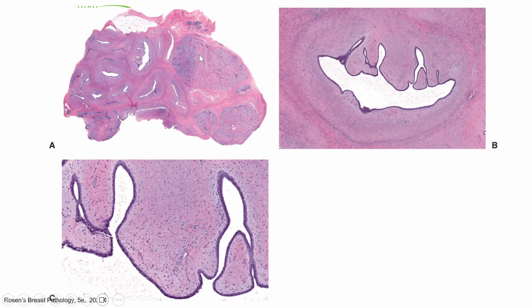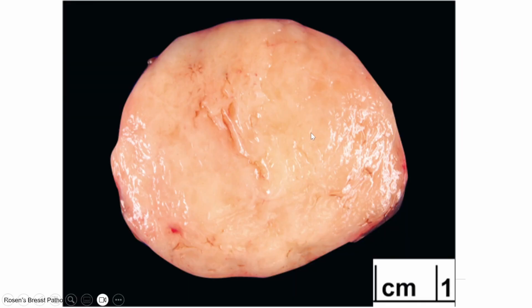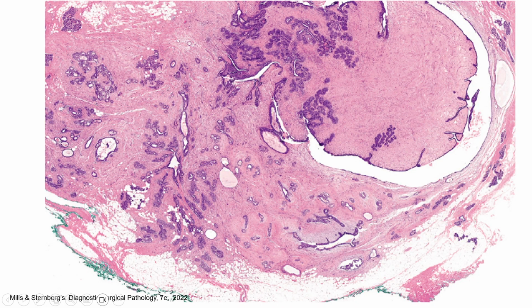But if you think you can make a diagnosis by core biopsy, you can imagine if the needle comes something like this, you could not see any leaf-like structure, and then you could really misdiagnose. Another gross finding for this phyllodes, still well demarcated fibrotic stroma cutting surface. But here we can see a little bit like infiltrated growth. But at low power, we can still see this leaf-like structure. So this is a phyllodes but suspicious for borderline.